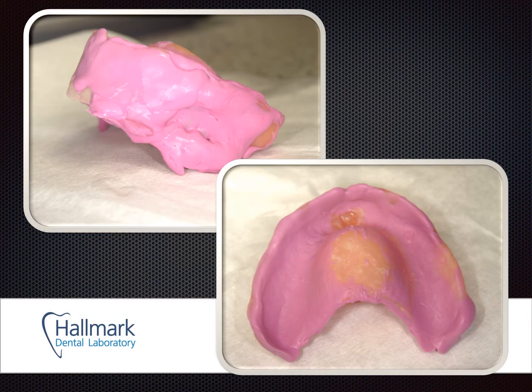With the digital record captured for the lower, we move to the analog portion: the reline of the existing denture, which I'm using as a tray. Using a light-bodied material, I put that in the denture and seat it intra-orally. It is critical when taking this type of record to have the patient bite to set the occlusion. Many clinicians try to hold the denture like a tray, but it's sensitive to rocking — anterior, posterior, or lateral — and will throw off the occlusion. Areas where the denture bottoms out are the most well-adapted areas; where we see polyvinyl impression material, there is a gap between the existing denture and the current tissue.